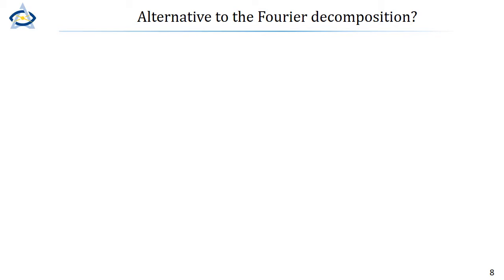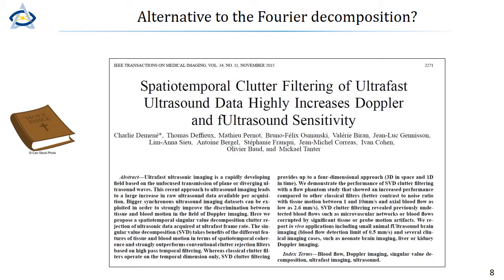So luckily, this is a very common problem in medical imaging. It has been met elsewhere, and especially in acoustic Doppler imaging. And so we implemented a solution that was found for ultrasound Doppler imaging, and it's very remarkable how the context, the problem, the solution are very similar in optical and acoustic Doppler imaging. So this is a very nice paper that explains things very well.